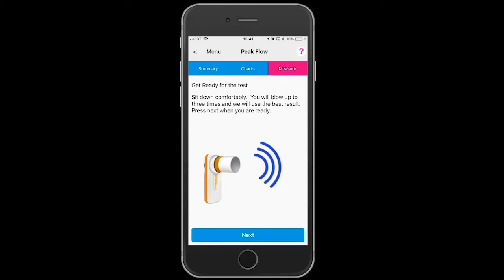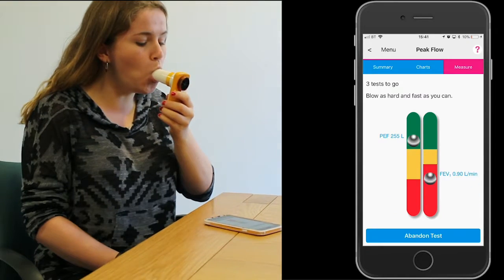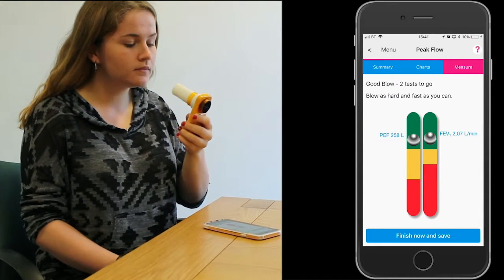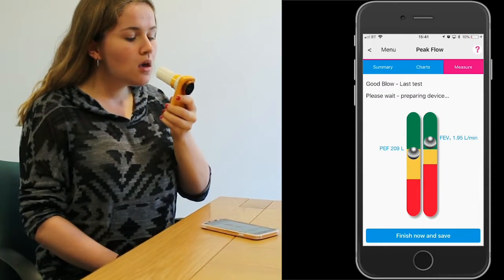Blow hard and fast as you can for three blows, and you want to push the little silver balls as far up the cylinders as you possibly can. Take a few seconds if you need between blows.